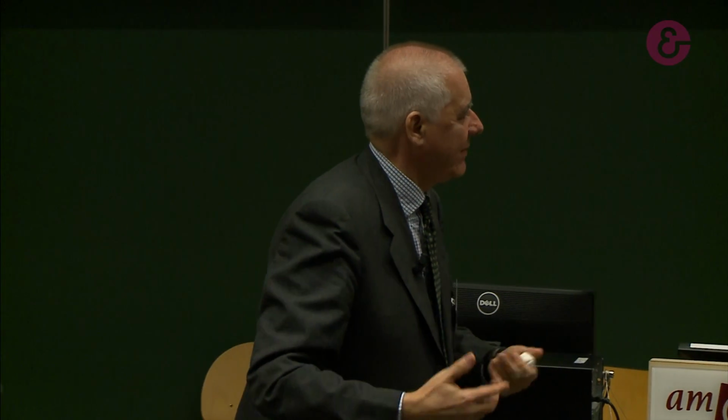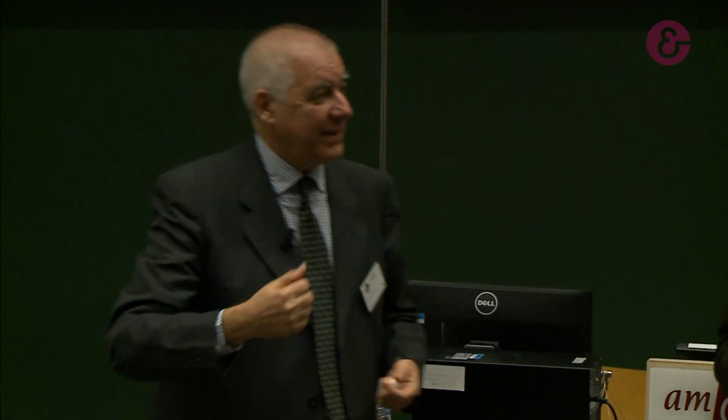The most important thing, I believe, is you must like it. There is no other way. If the patient comes, you can see in a few seconds there is nothing, there is no local problem. You start examining the anatomy. You start seeing, let me see if I can see this small nerve over there. Let me see if I can see this variation. So the patient is very happy because you look deeper.